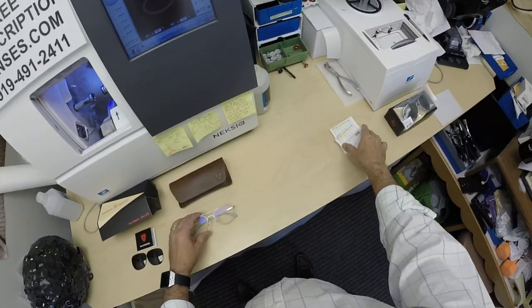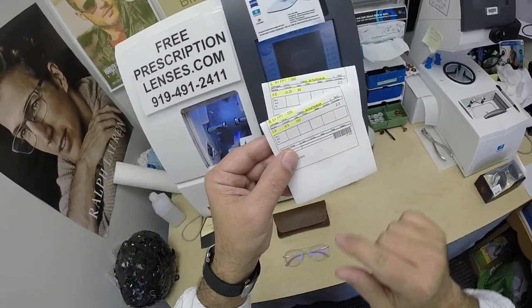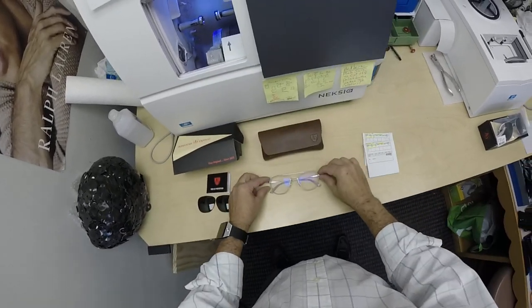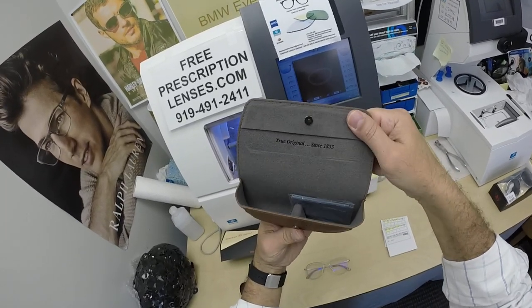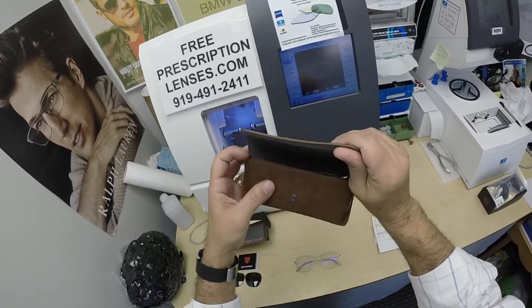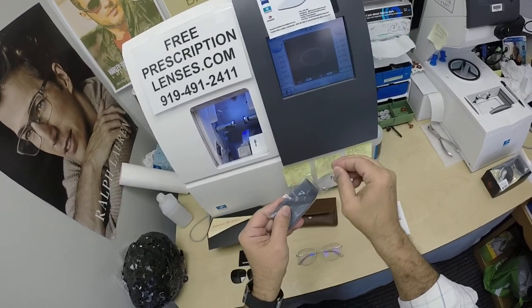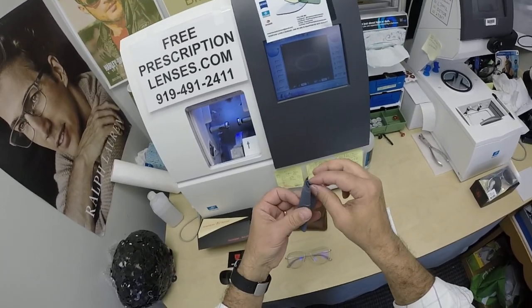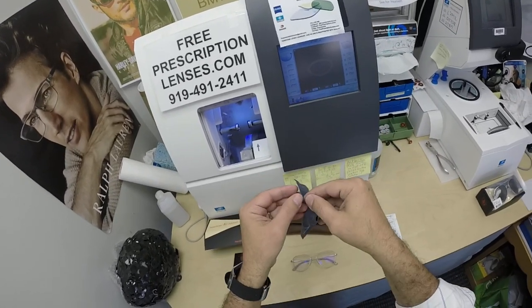He got the Zeiss Photofusion gray lenses with DuraVision Platinum anti-glare coating. I've highlighted the prescription for the right eye and did the same thing for the left. And of course, you're going to get the American Optical really nice fold-over leather magnetic snap-closed case. And I hope he doesn't mind — this is the American Optical cleaning cloth.